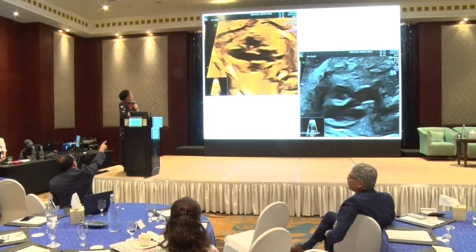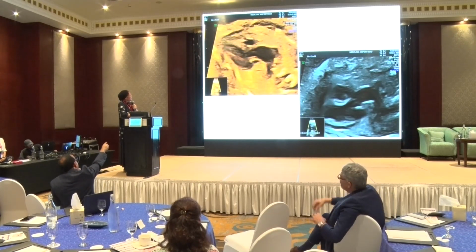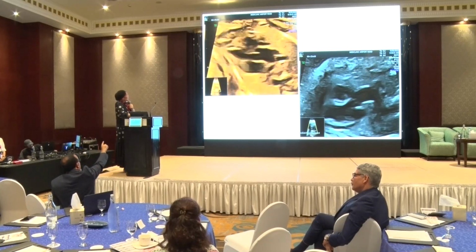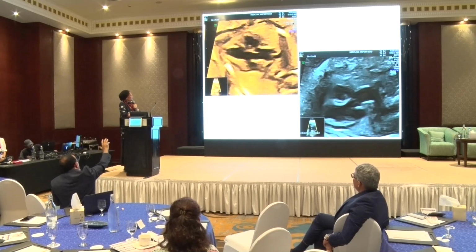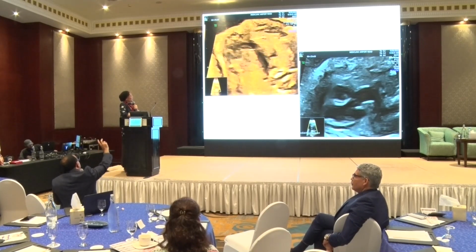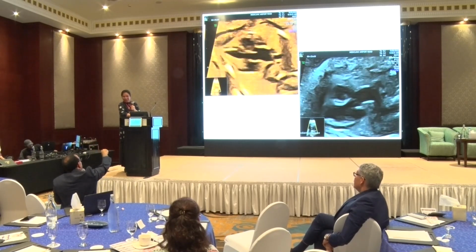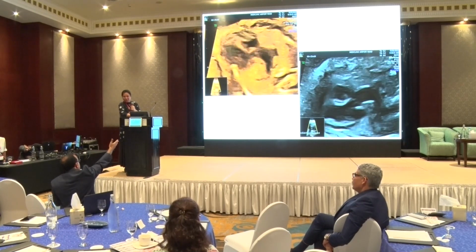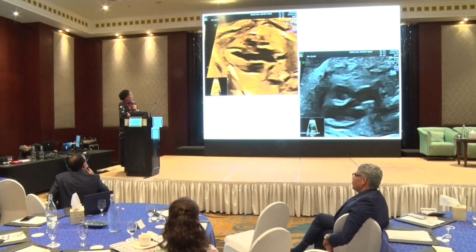There is an outflow going, or VSD, you can call it whatever, and the other major artery comes solely from the right ventricle. The first one is probably overriding. So in my mind this is still right ventricle hypoplasia with double outlet, or if you want, you can say overriding pulmonary, and the aorta is far more anterior. That's how I see it.